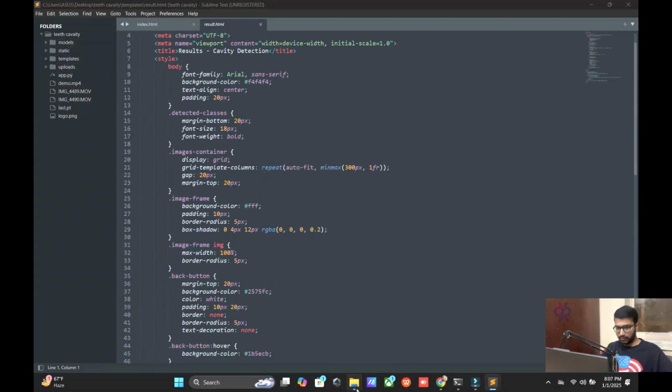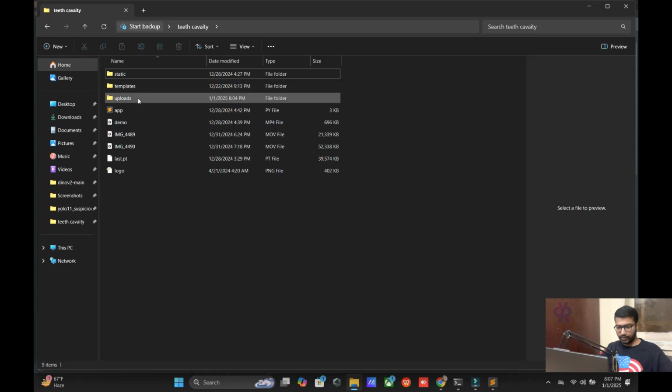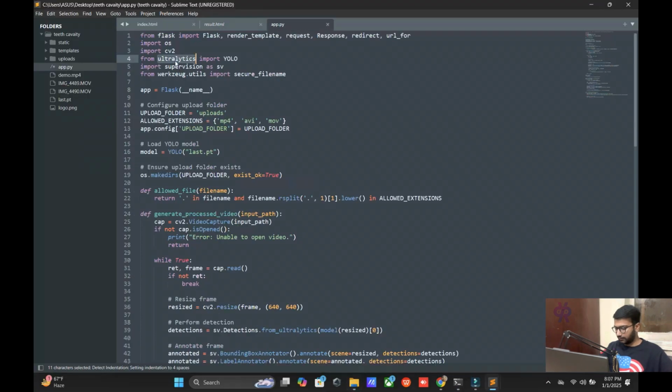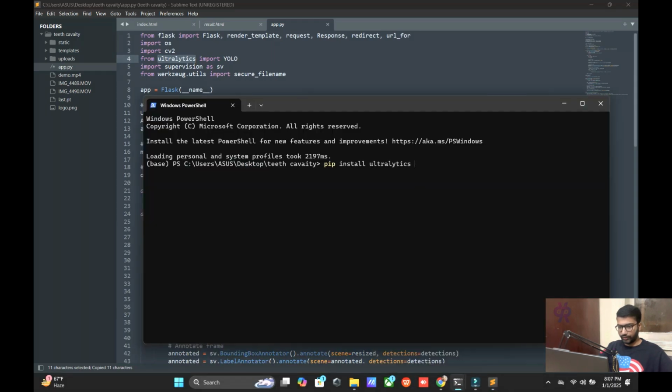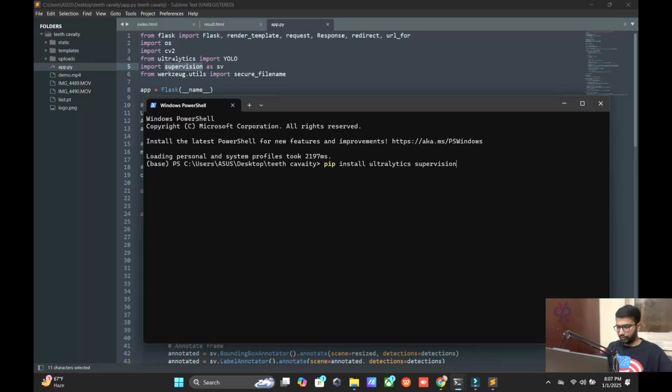Let me delete it from our side. Here, now first of all, you open your terminal, the Windows terminal. If you are a Windows user, you follow the same instruction. It's the same for all of you. Hit install. Here in the app file, we need the Ultralytics library, the supervision library, and here OpenCV and Flask.